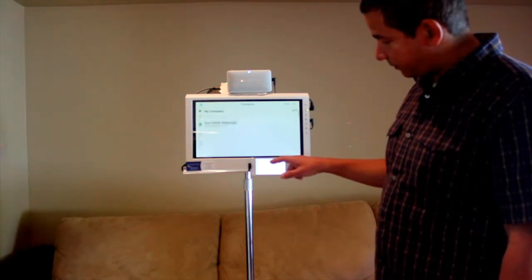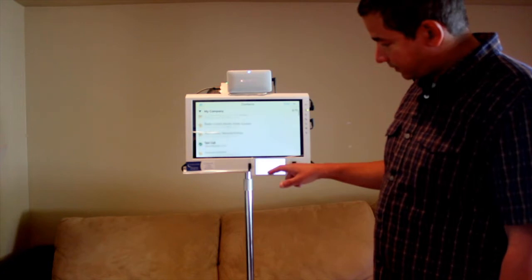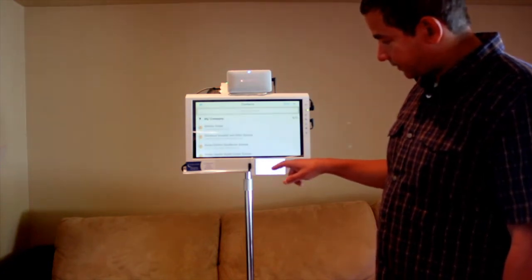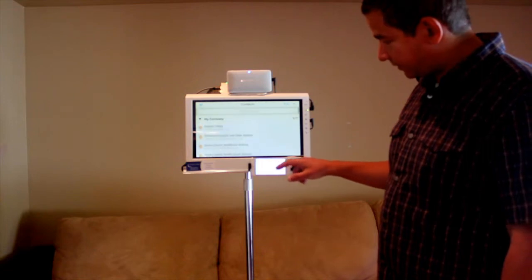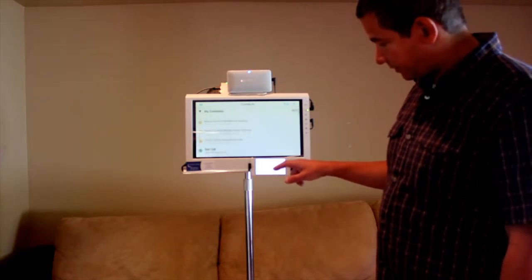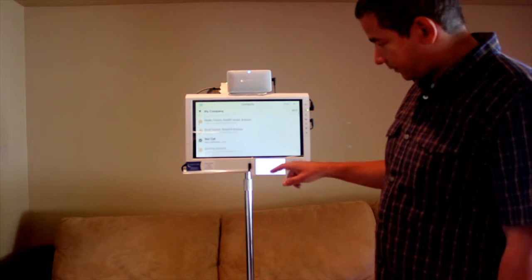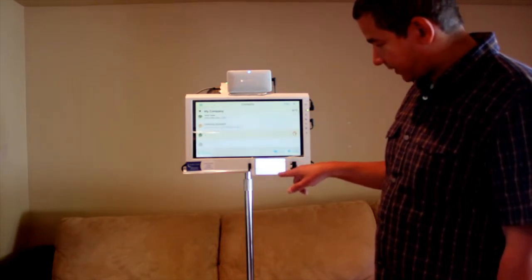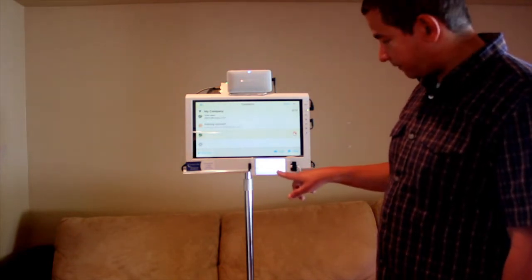Once your address book is open you can scroll through it and find the person you want to contact. Once you find the person you want to contact, you press on their name and initiate a video call by pressing on the call button.